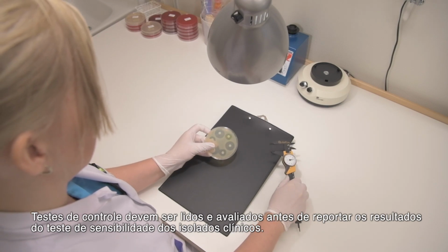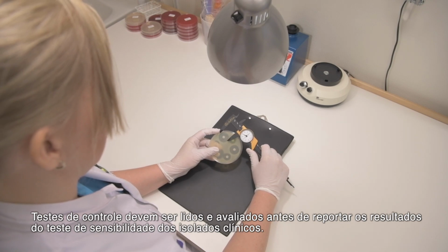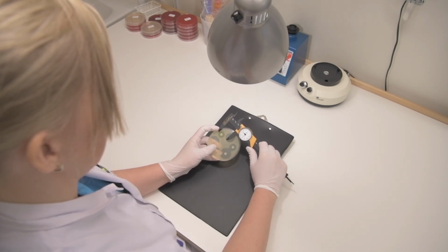Control tests should be read and evaluated before reporting susceptibility test results for clinical isolates.